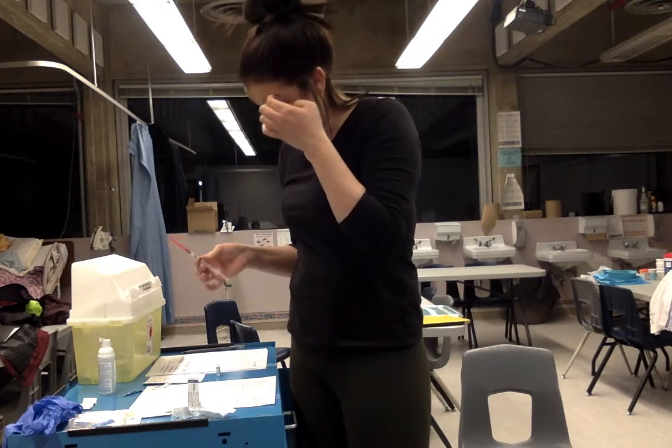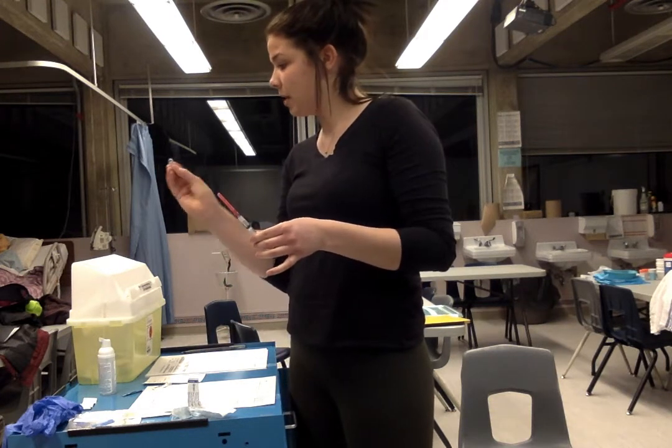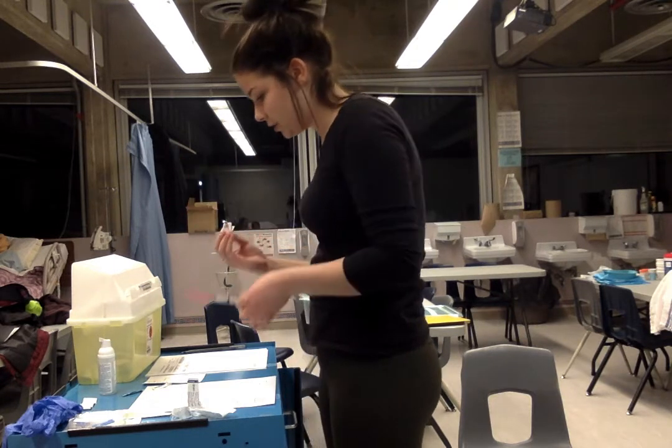All right, so now I'm just going to do another check here. We have morphine, 10 milligrams per ml. And then here we have morphine, 10 milligrams per ml. So we are still the right drug in here.